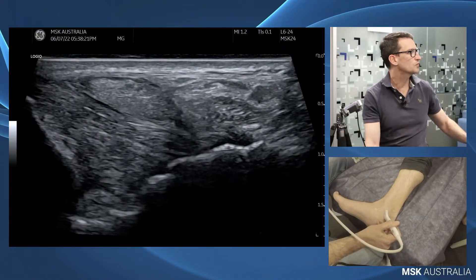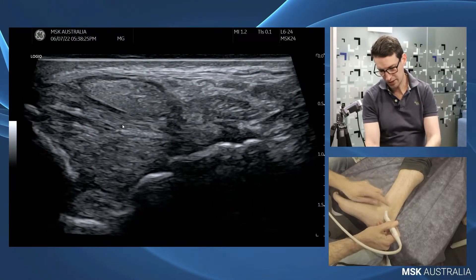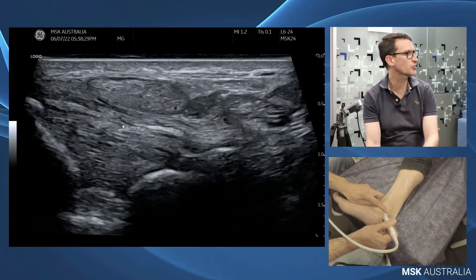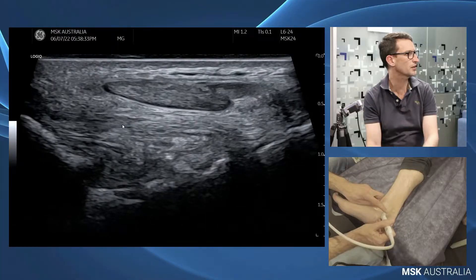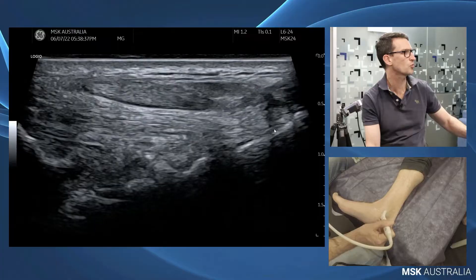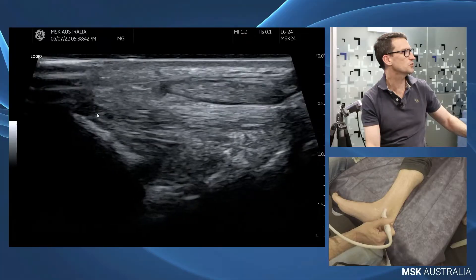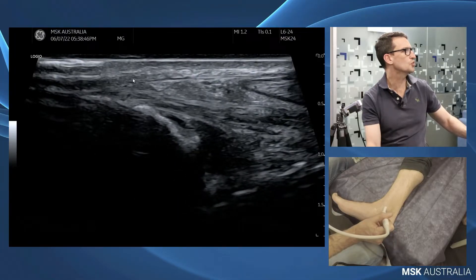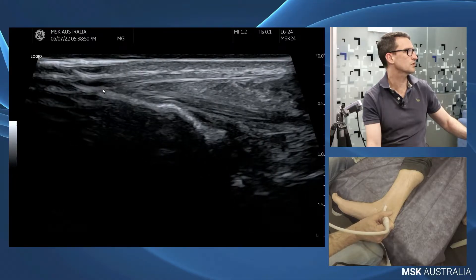As we scan forward from here, we keep our toe anchored on the malleolus to stay in our deltoid and just roll the heel of the probe around. I want to roll the heel of that probe around until I get our calcaneum in view and our sustentaculum tali, which is this prominence of our calcaneum here. So this is our calcaneal-tibial ligament, and as we come up we can see that plugging in there, merging in with our flexor retinaculum and inserting onto our tibia.